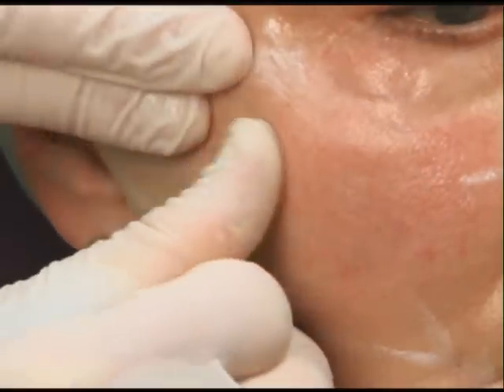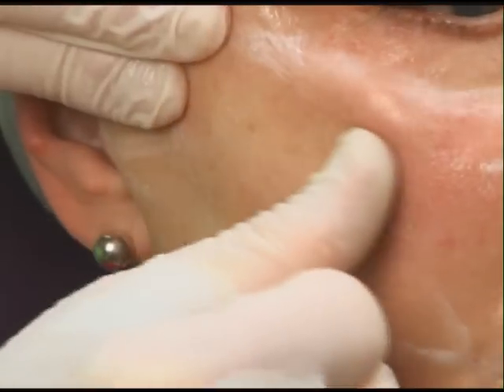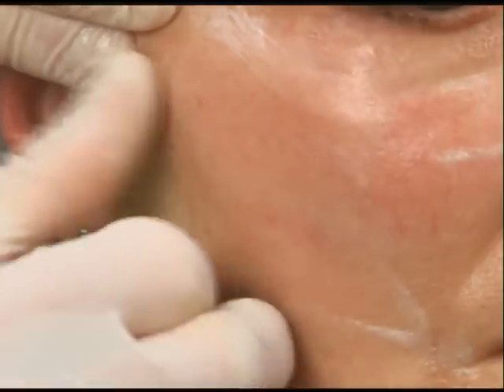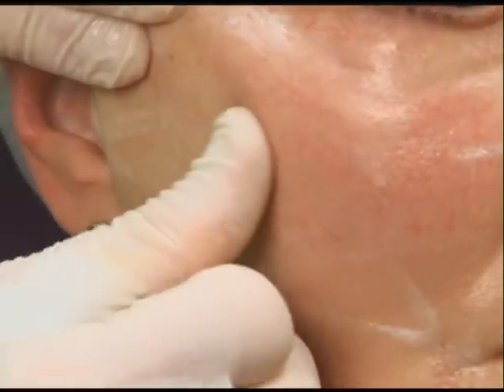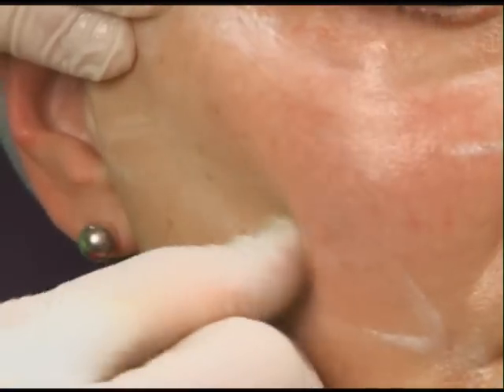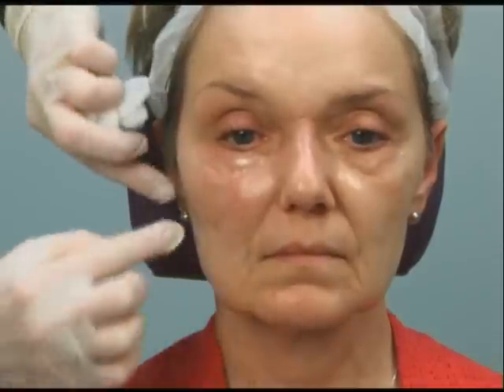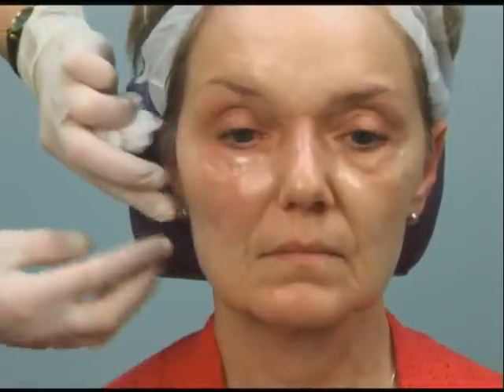Here you're usually injecting a larger amount, a larger volume at a time. So you can easily put a syringe in with just one puncture and fanning it. I have to be careful not to inject too fast because it does hurt if it's fast. And then I'm going to put some in along this area here too, to kind of just help pull back on the jawline.